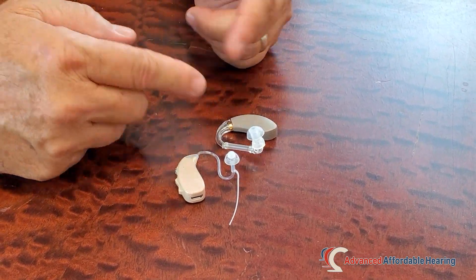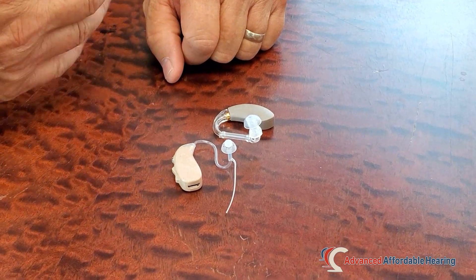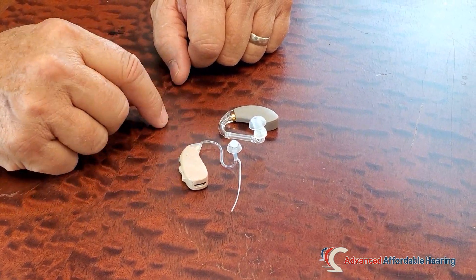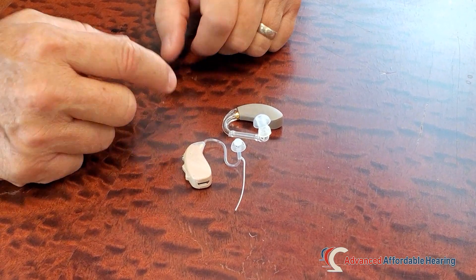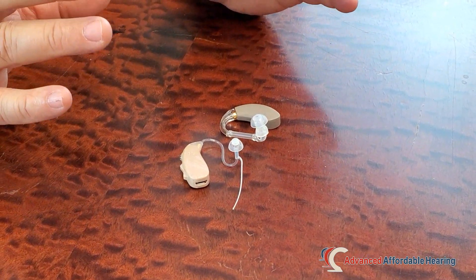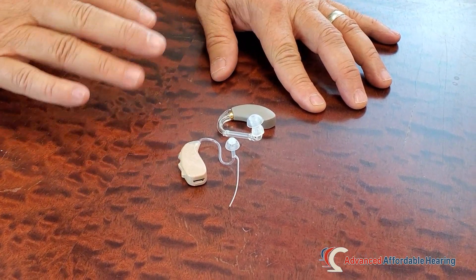Much more volume of sound will come through here and allow you, if you have very severe hearing loss or even profound hearing loss, that greater volume of sound will help to give you more — just plain louder and clearer — and also give you access to deeper pitched tones, lower notes.